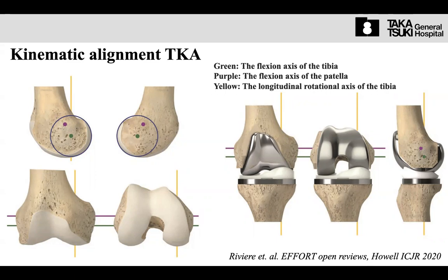During flexion, the tibia rotates, what can I say, internally. And then in extension, the tibia rotates externally. So it is the so-called screw-home movement. So aligning to this line, theoretically, in the kinematic alignment TKA, we should use a single radius component and a medial pivot component.